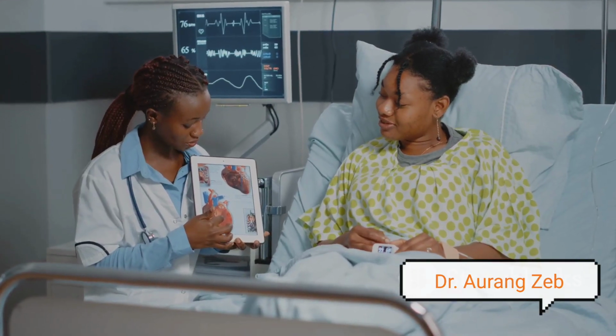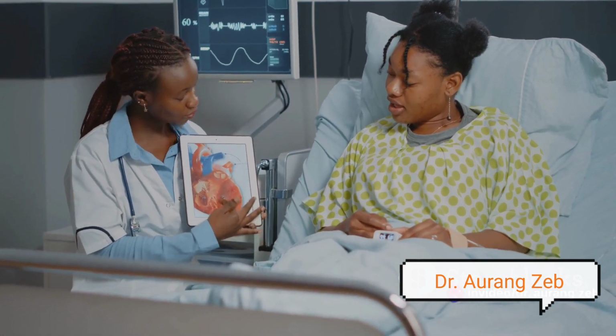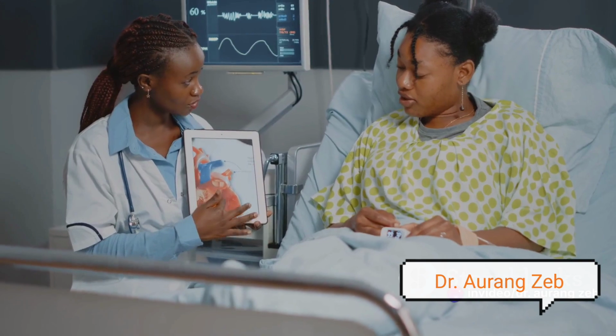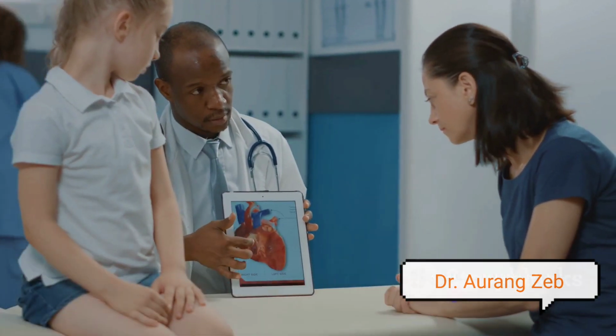Remember, the report is not just a collection of findings. It's a communication tool that aids the referring physician in understanding the patient's cardiovascular status and planning further management. And that, folks, is how a transthoracic echocardiogram is conducted and interpreted.